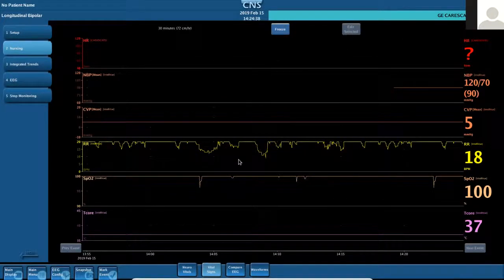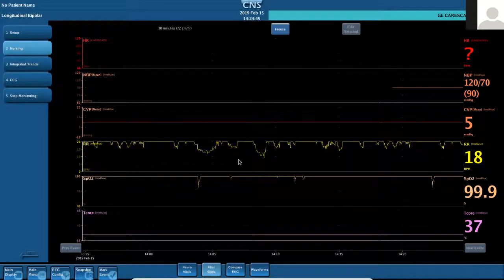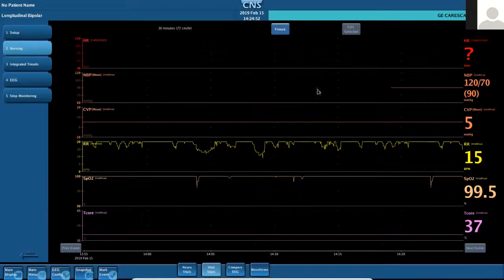And I like the protocol, labeling the protocol with maybe a clue towards, like, this is for your Blanketrol protocol, or this is your Arctic Sun protocol. Exactly. So when we discharge this patient, we'll look at how we might rename a protocol based on the changes that we've made. Great. Thank you. That's great. Okay.